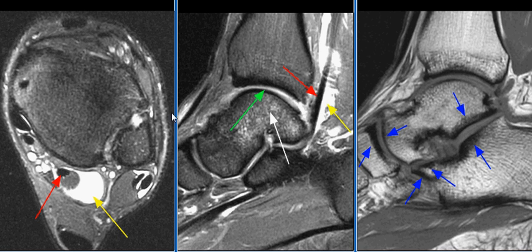This is a 25-year-old male patient with ankle pain. MRI examination shows moderate tenosynovitis of the flexor hallucis longus tendon with a moderate amount of fluid in the tendon sheath. The amount of fluid in the tendon sheath is disproportionate to the very small amount of fluid in the tibiotalar joint.